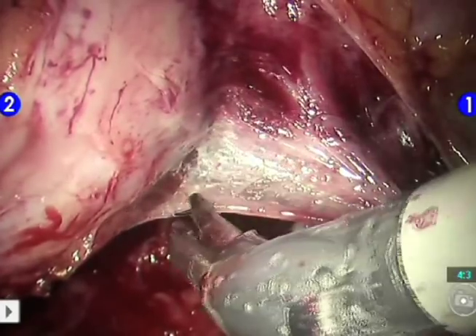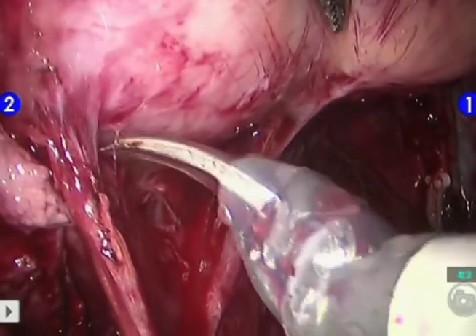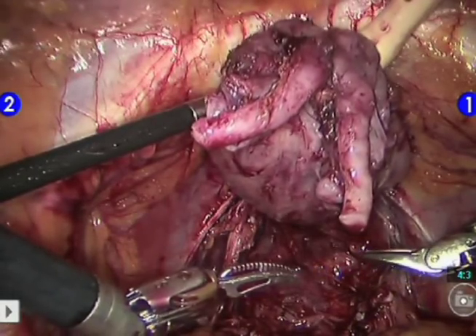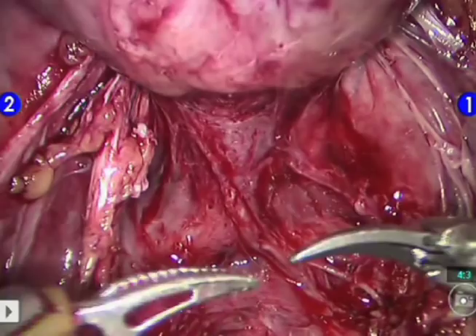Next, we release the neurovascular tissue using our trizonal neural hammock release technique and control arteries and veins as they enter the prostatic base. At this point, the prostate is mobile. It is lifted perpendicularly towards the anterior abdominal wall and pubic symphysis, affording a surprising level of clarity with which the white surface of the apex can be differentiated from the muscular urethra.